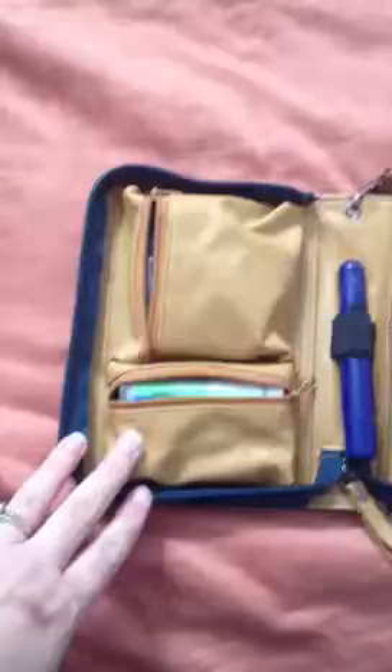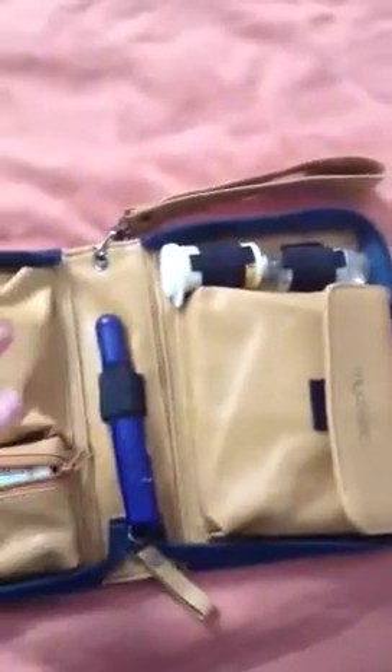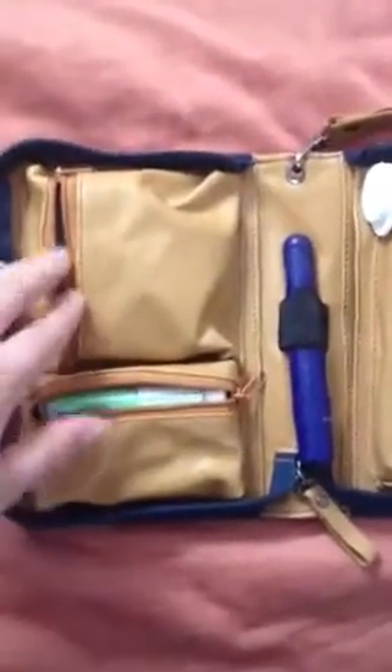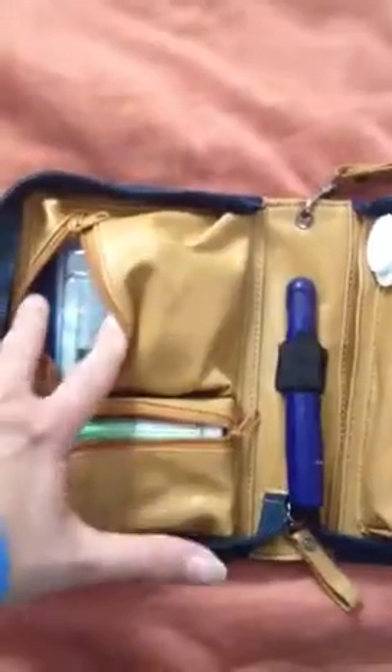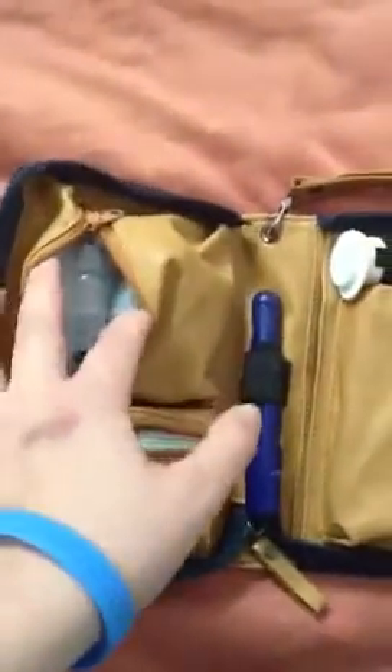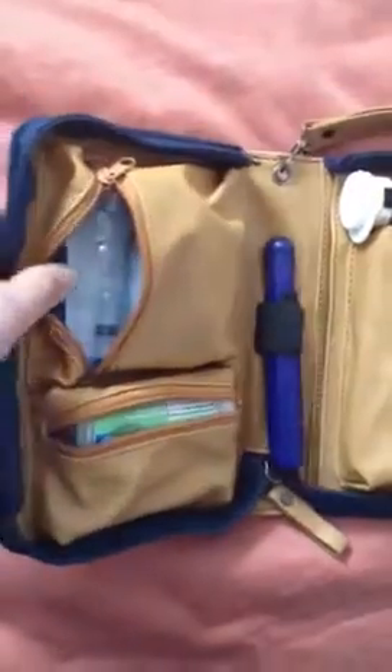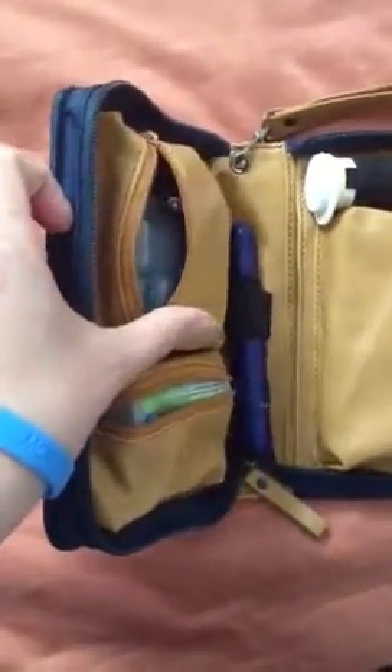It has a pocket on the back that I think my phone will still fit into. This is the interior — there's a cool little insert where you can put credit cards in it, but mine didn't come with that so I've contacted customer service, so we'll find out about their customer service. In here I'm able to keep some AAA batteries for my Omnipod, some alcohol prep wipes, and a spare Omnipod.